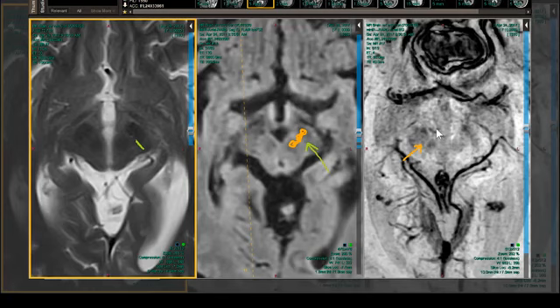But it's a big concept. The neurosurgeon is more interested in where it is than what it is, how he's going to get there. Is he going to be in the right place? If he's in the right place, he can deal with whatever it turns out to be. So this is going to be a big concept in spine, but also in the brain. Now, they do everything stereotactically these days, but when we get to some of the strokes and the tumors, you've got to know the approach, how they're going to get there, so you can comment on what issues they may have in getting to these things. So these are some of the concepts we're going to try to develop.